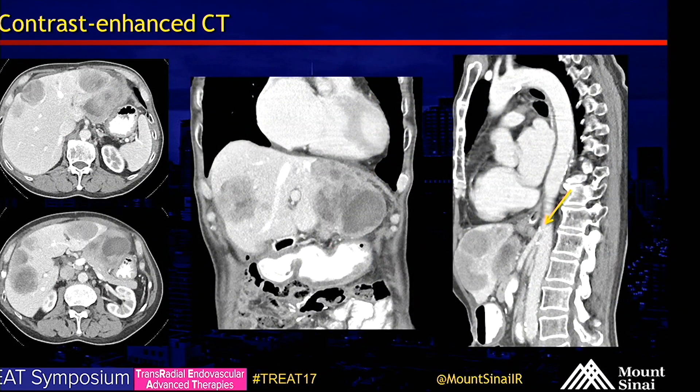Contrast-enhanced CT showing multiple hepatic metastases. We also note off the aorta, the celiac and SMA come off at a very smooth angle when approached from above.